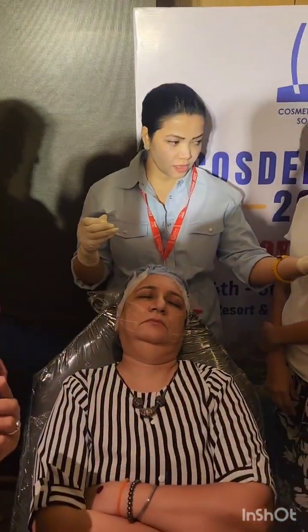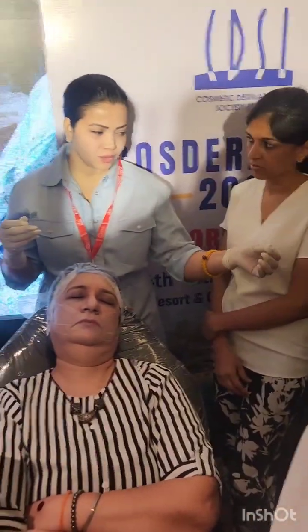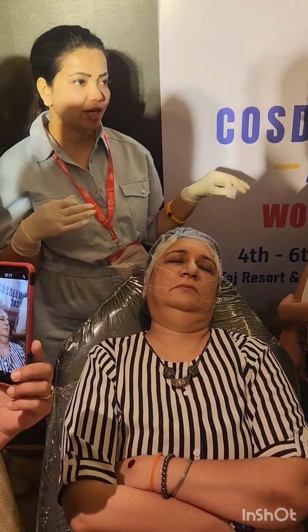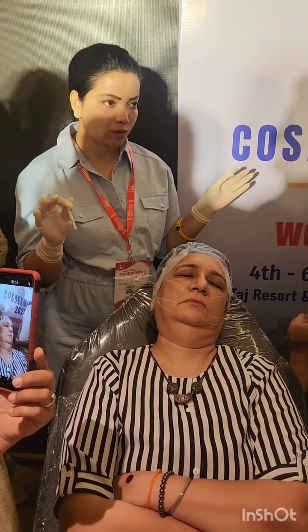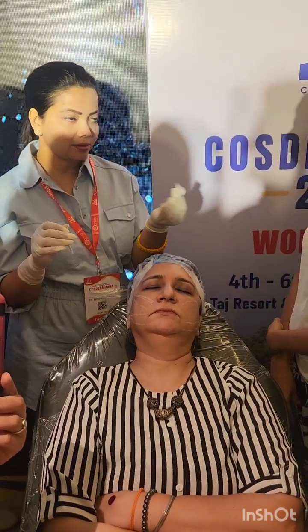All these 3 arteries. We don't do massage. I don't do it. See, it's been long. I have been doing it for 9-10 years, so I know every aspect of thread, what can go wrong. Even if it's projecting, I've never seen granuloma formation happening. It subsides in a month, right, Aditya?